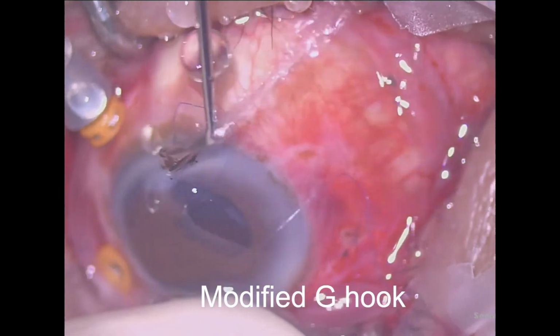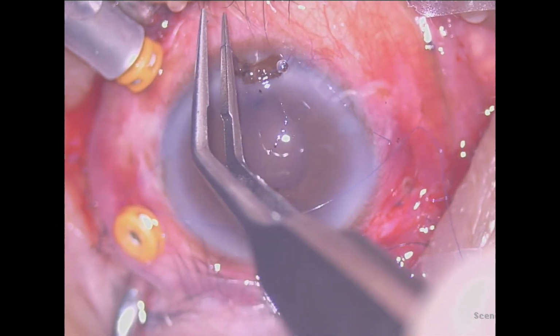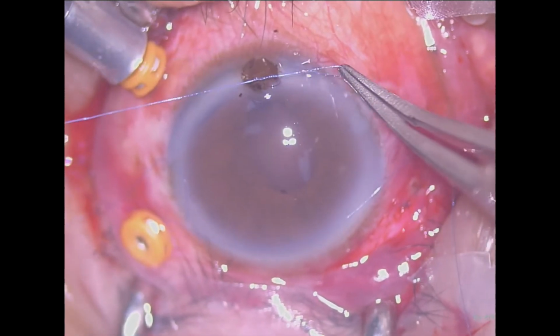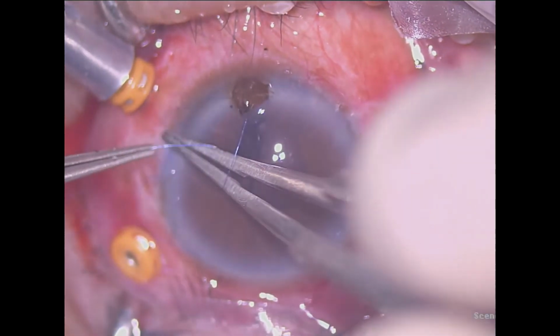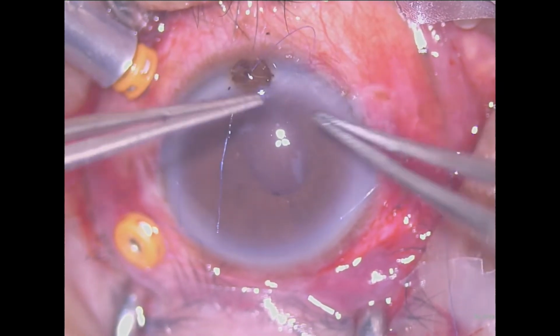Most surgeons prefer to repair the iris root followed by pupilloplasty. My approach here is to perform the pupilloplasty first for my desired pupil size. After the iris repair, the pupil size should not be too small or constricted, since we still need to insert the intraocular lens and for fundus examination in the future.